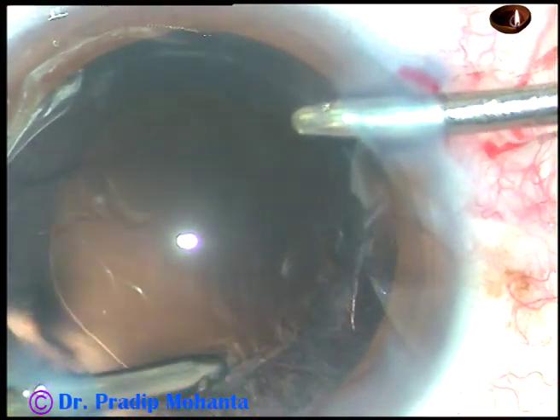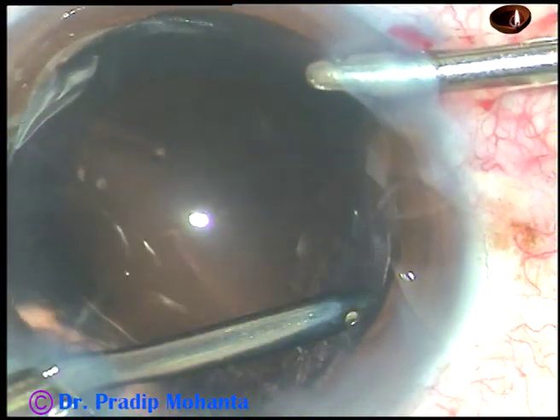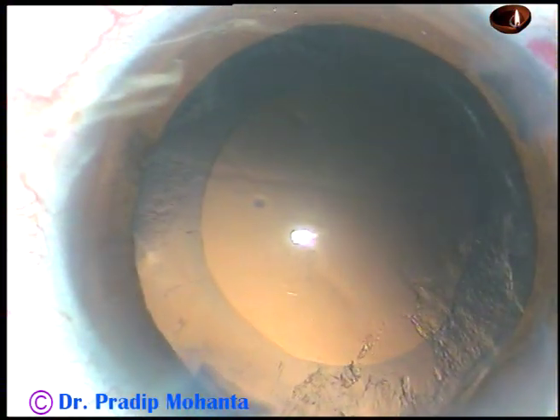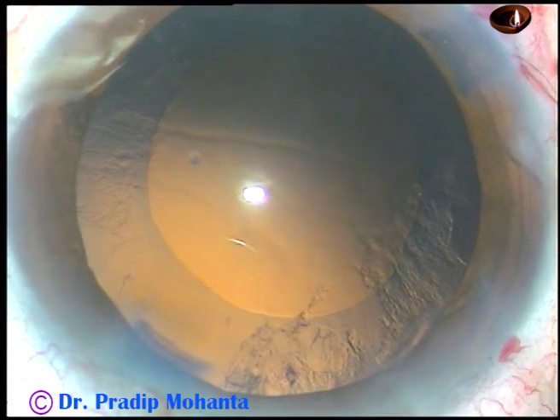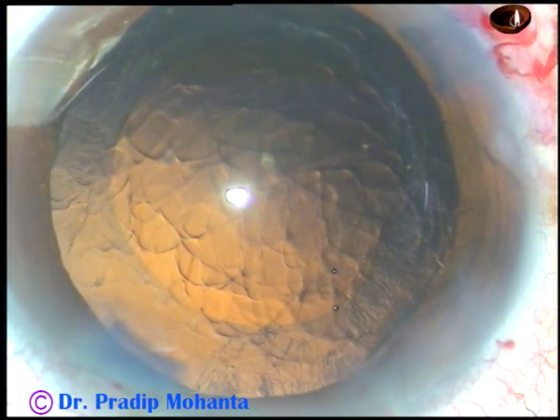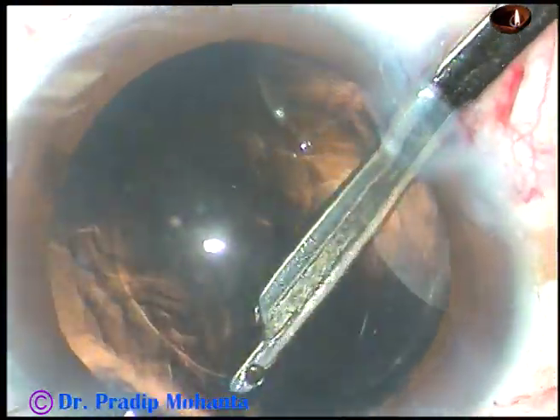Now this is bimanual irrigation aspiration. As I tried to remove the cortex, I caught the posterior capsule. So I just could not remove the cortex nicely, came out, and injected some visco. Now my plan is to go through the side ports with the Simcoe and to remove this cortex nicely.